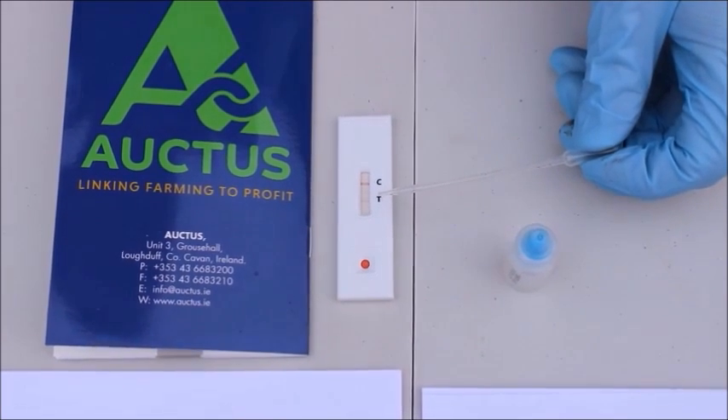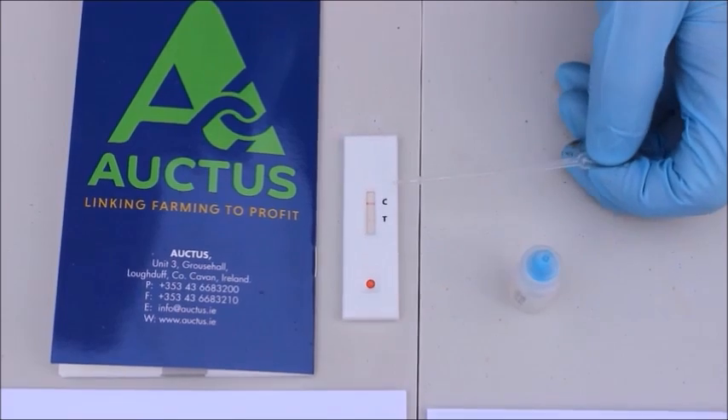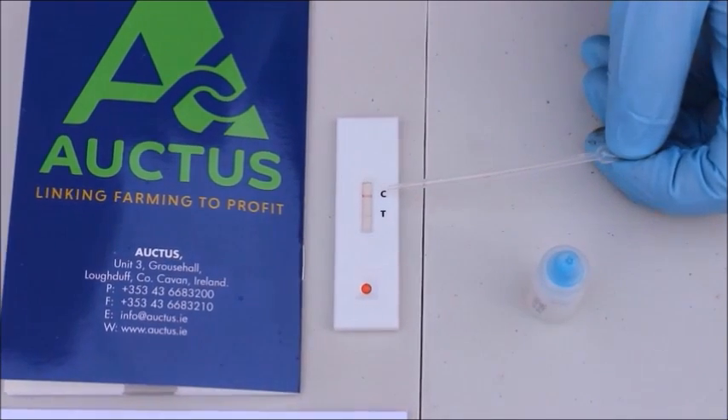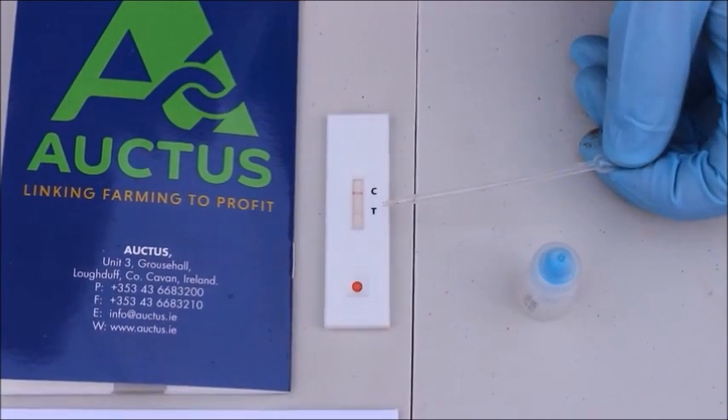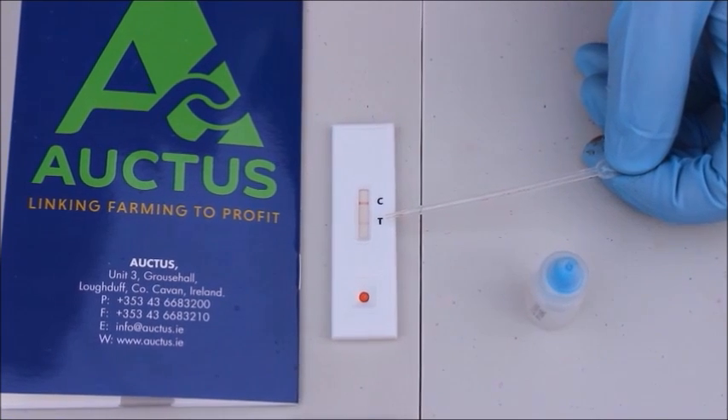After the ten minutes have elapsed, we can see on the test cassette that we have a control line very evident, which indicates the test is working. We also have a test line very evident as well, which indicates that the cow is pregnant.